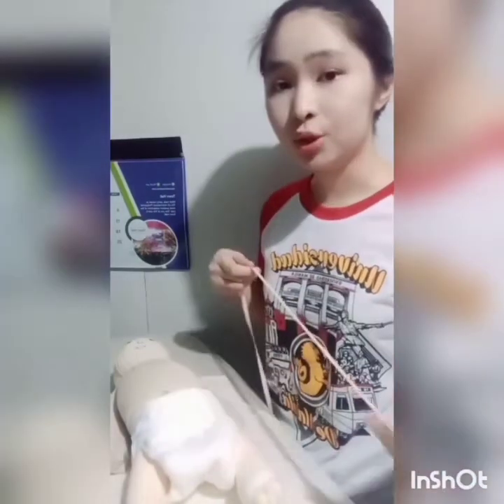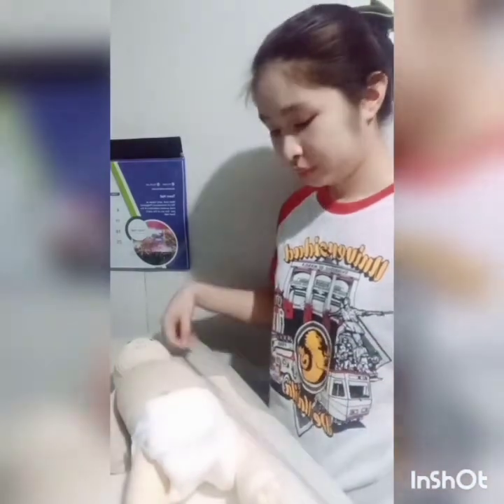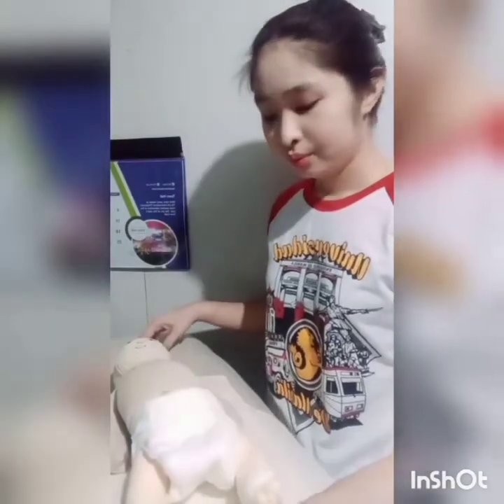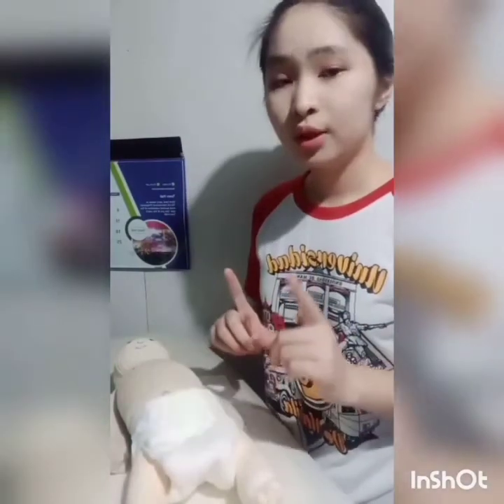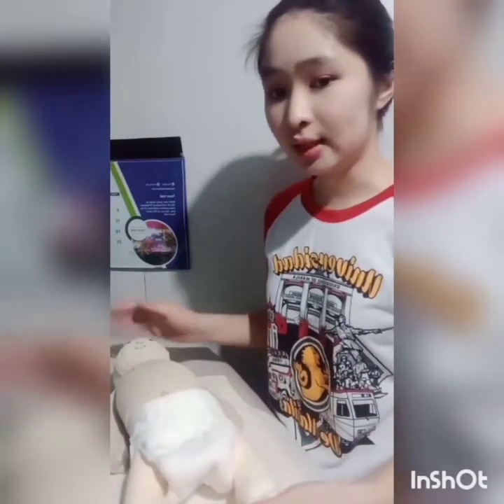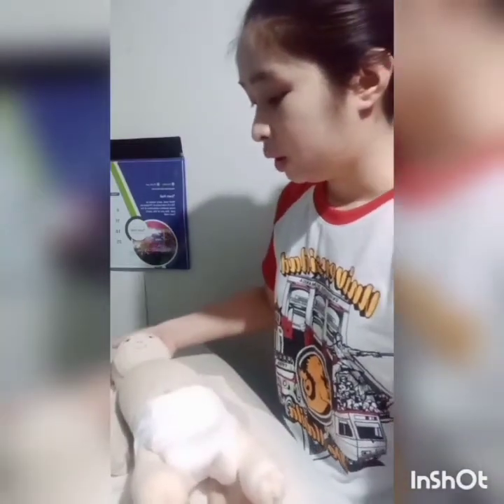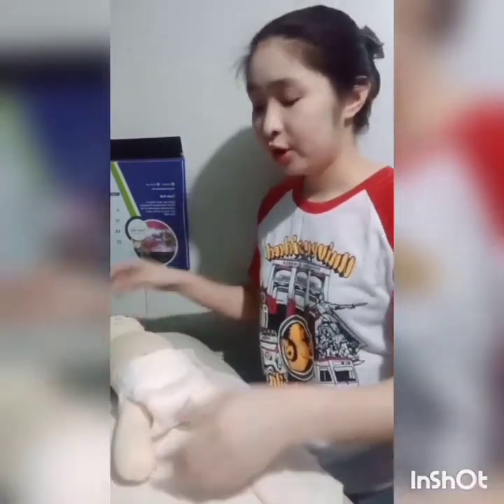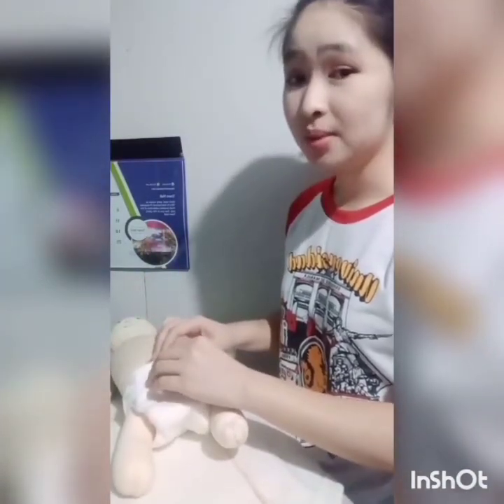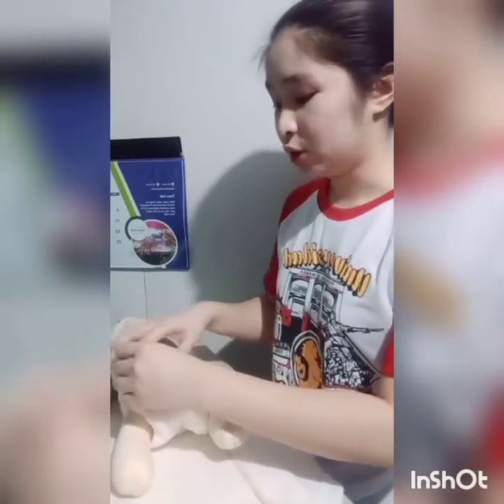So in getting the measurement, we are going to use a centimeter tape. And we should take note that for us to easily bend and extend or stretch the baby's legs, we should remove their diapers, that sometimes hinders the baby's legs to be stretched.